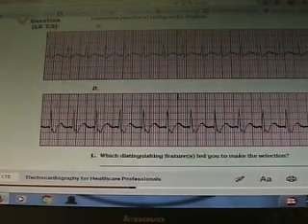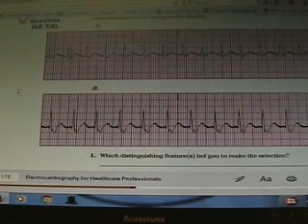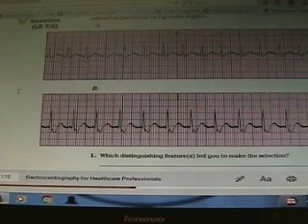Okay. So between A and B, which one's the junctional tachycardia? A. You sure? So B. Which one has the obvious upside down waves? B. They're both tachycardia, but then I gotta look. The PQRS seems smushed.